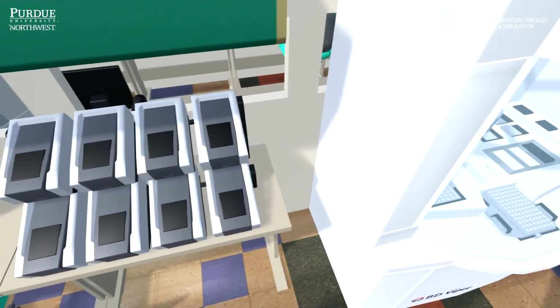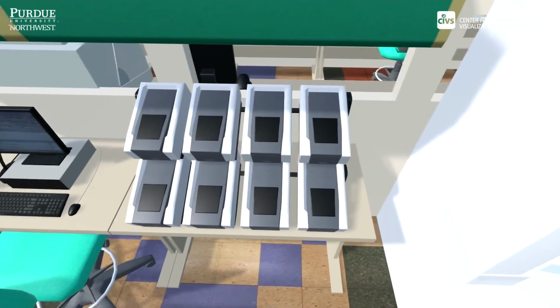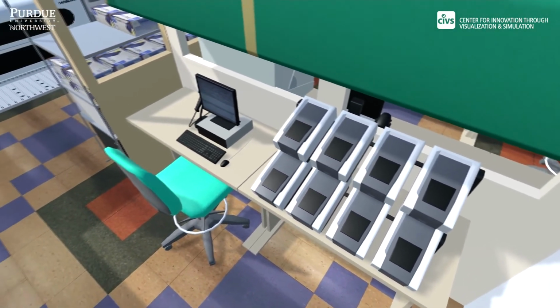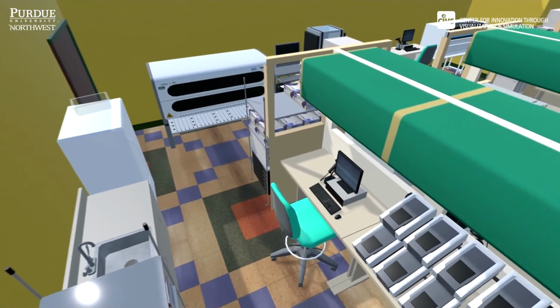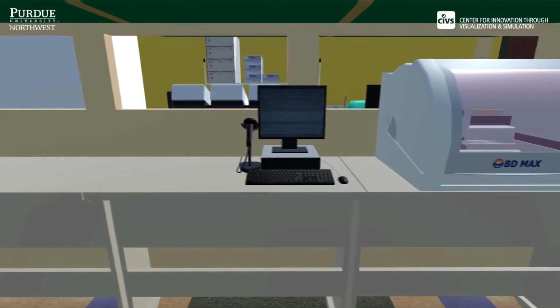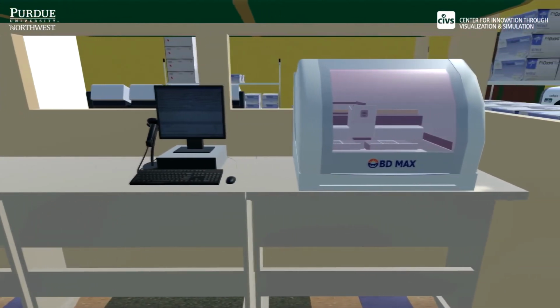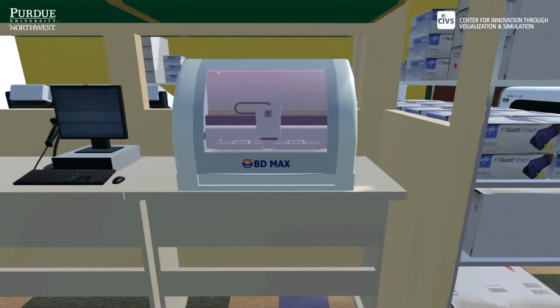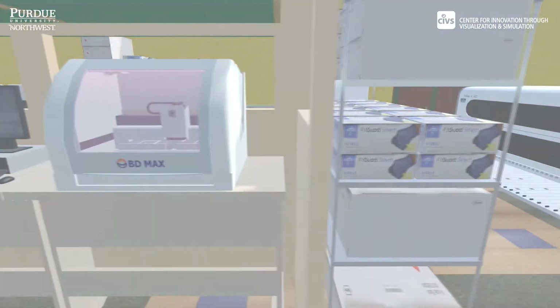Test panels can be performed to identify many pathogens that can cause respiratory infections, wound infections, gastric infections, cervical infections, or blood and spinal fluid infections with comprehensive results in a few hours. A patient's sample could also be tested to ensure they do not harbor an opportunistic microorganism such as MRSA that could cause severe complications in an immunocompromised patient or a patient about to undergo surgery.